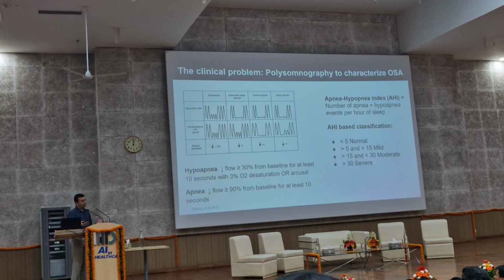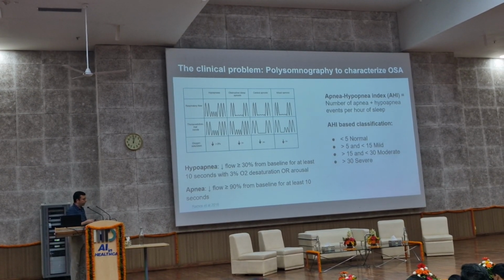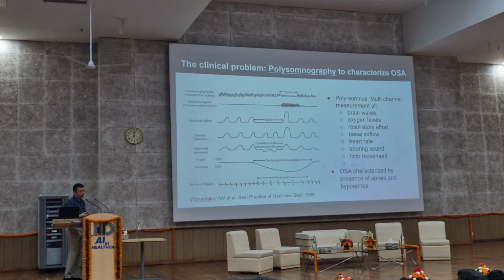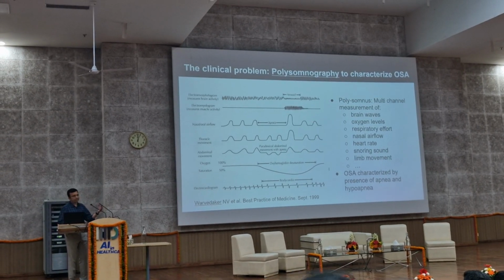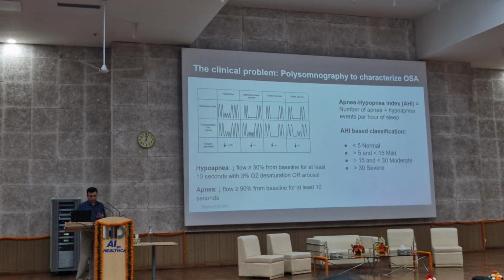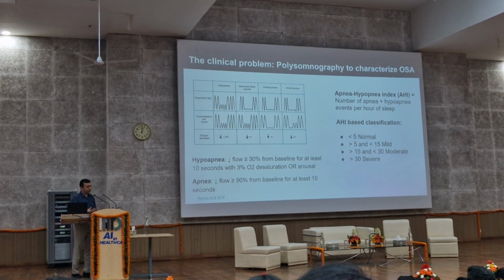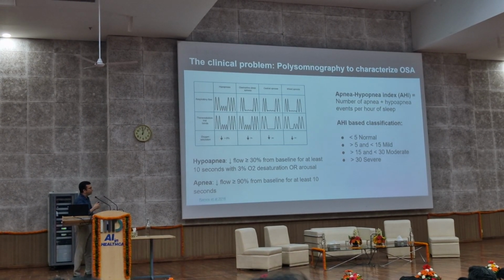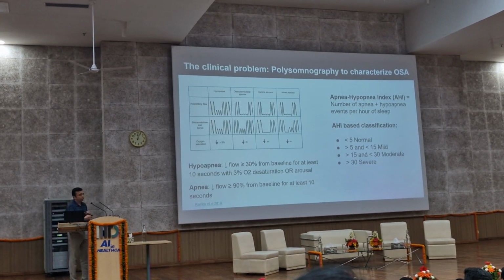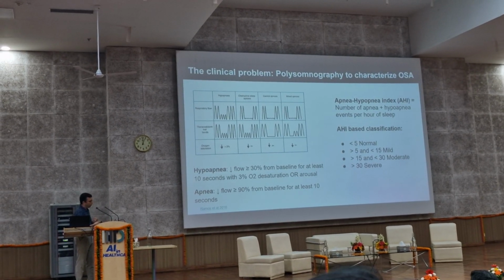Now, you can think about this being a pattern matching problem, right? If I go back and show you the slide, finding out these patterns should not be really difficult, right? But what is happening is this cycle is something which is happening over an 8-hour period, and the instrument which helps capture this sort of signal right now is not fully automated in that fashion. So it will give you some sense of where these apnea and hypopnea events happen, but it doesn't really tell you at which stages, how confident it is that it is actually an apneic event, and so on.